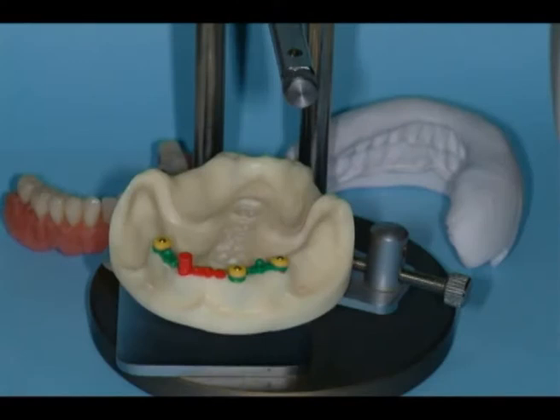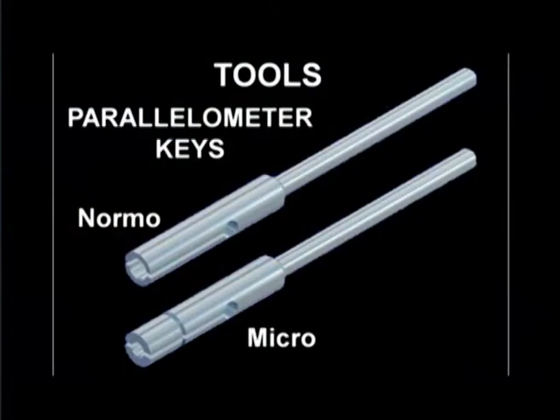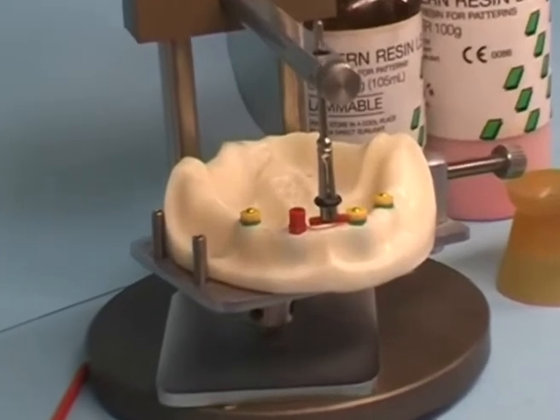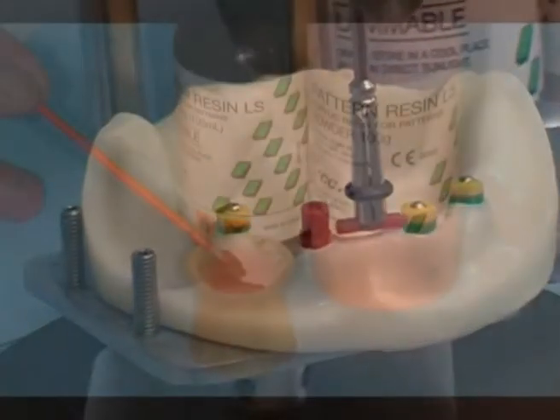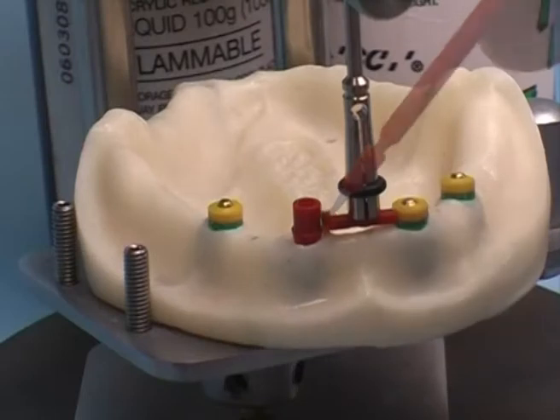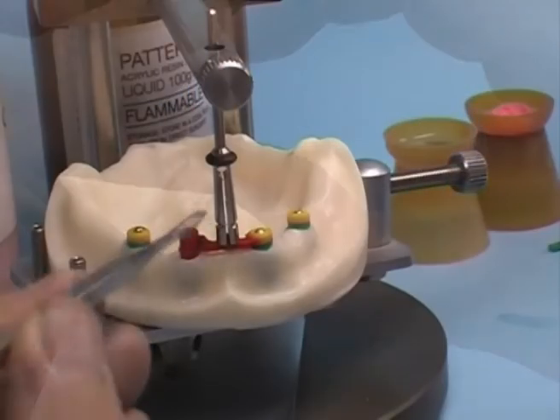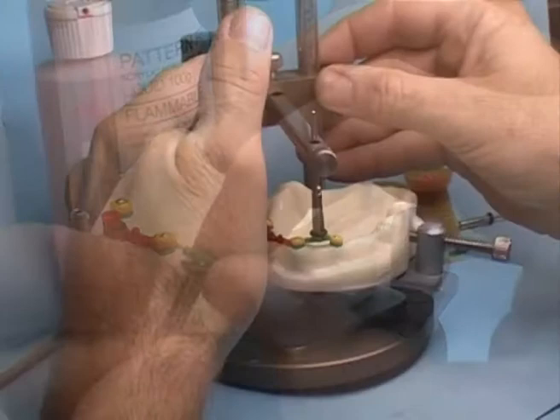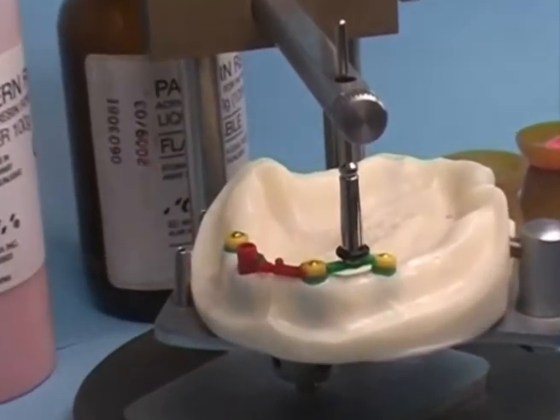Prefabricated castable OT box components are used to build up the bar structure. Mounting of pieces of bars with spheres will be done in parallel using their proper mandrels. Cure them with resin on one side only, to the castable pieces of the rings on the attachments. Wait for the resin to cure perfectly in order to avoid retraction, and proceed to cure the rest of the parts and the other sides totally until the whole structure is completed.